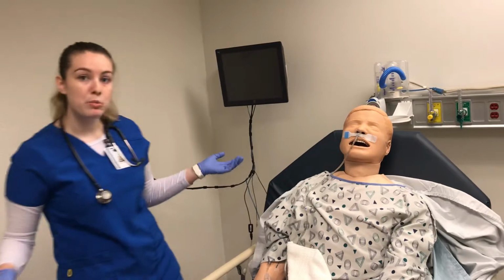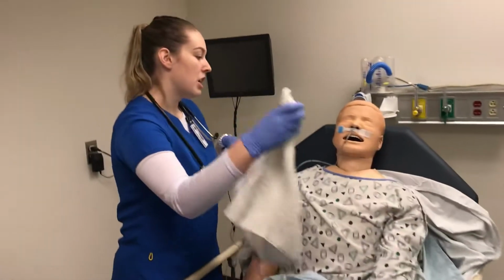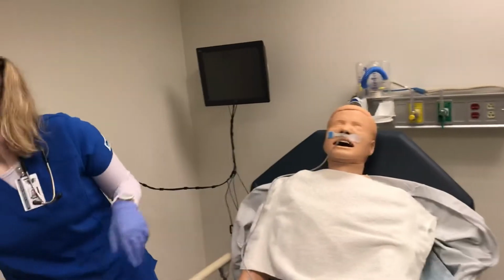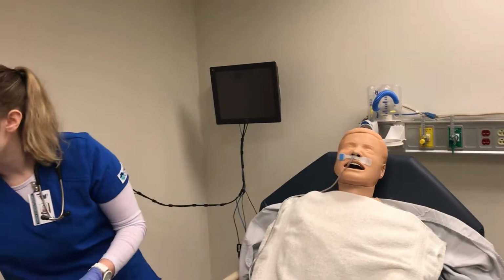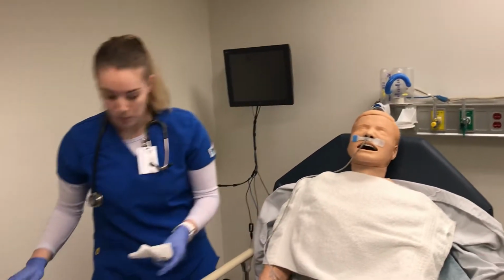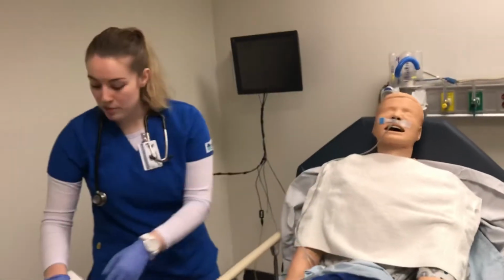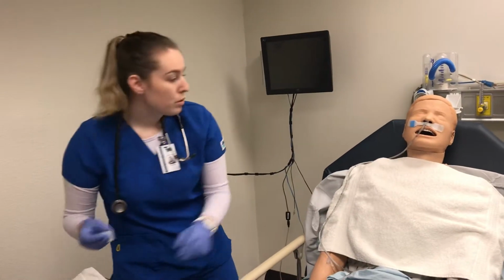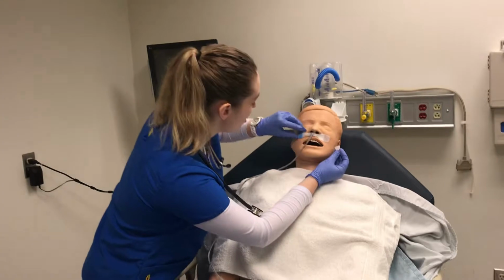Good. Okay, and then I would remove it from suction, as she would have been hooked up to suction now. So I'm just going to put this across your chest. And again, I have my gauze, and I have some Kleenex and an extra towel. So again, I have some Kleenex for you, Shirley. I'm just going to take this adhesive remover to help remove the nose strip.